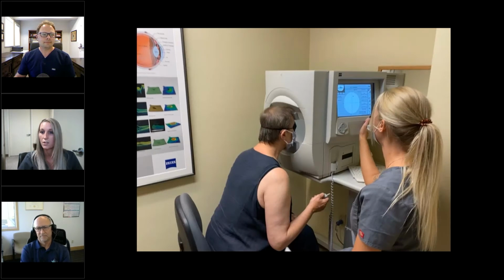So with the Humphrey visual field, as you can see, she's pretty stiff and she has to go in there pretty straight. And there's a lens. She has to wear a patch as well. And I will tell you right now, the patients hate that patch. And there's a lens that has to go all the way to her eye, touching. Otherwise, it'll cause a ring scotoma, which will make us repeat the test. And before we learned how to really determine what the test meant when it was printed out, we didn't know. And the doctor's like, hey, this is probably from the trial lens and you need to go redo that. And so we'd have to redo it again.